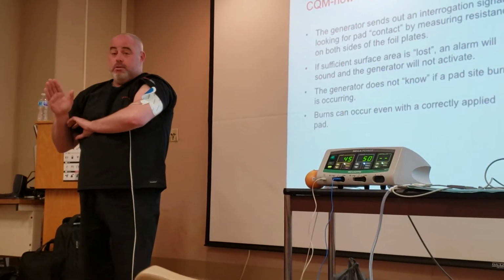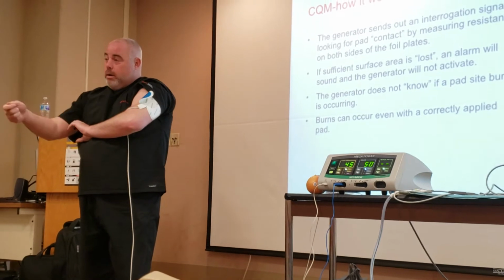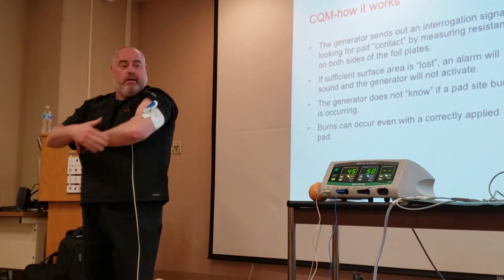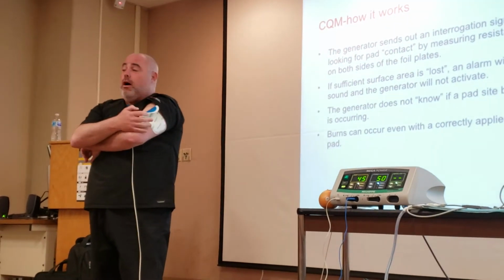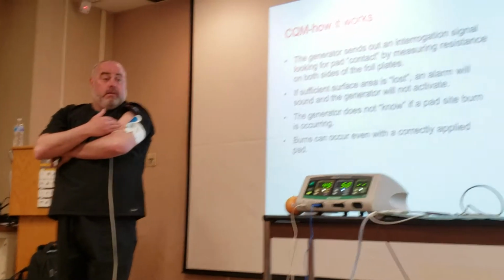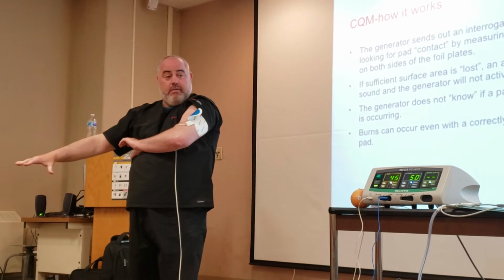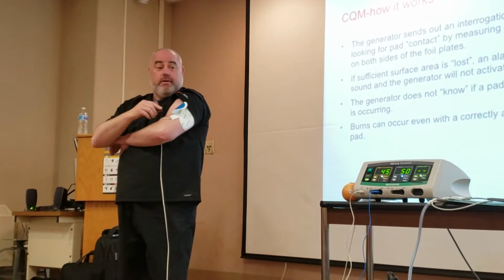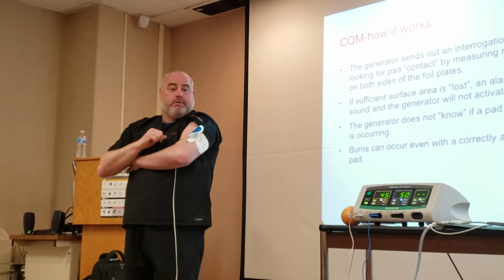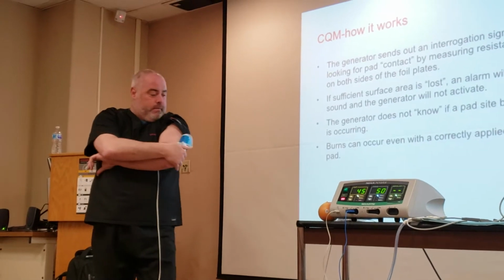What it's doing is, remember, it interrogates the pad for its surface area. When you unplug it and plug it back in, you have reset the surface area. It now thinks what is left on my arm is the complete surface area of the pad. Again, remember, high current concentration to a dispersive area. I now have less surface area. Is this a potential electrosurgical safety problem for your patient? Absolutely. If I continue to pull this, it will alarm again.